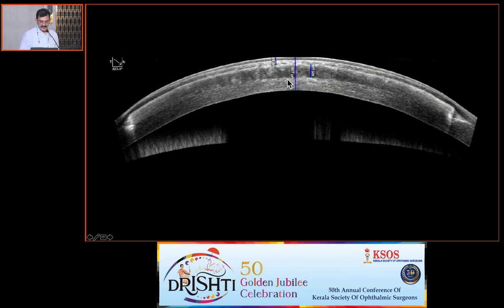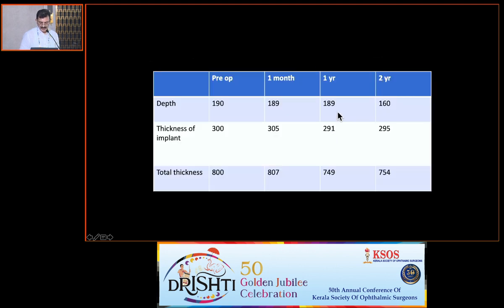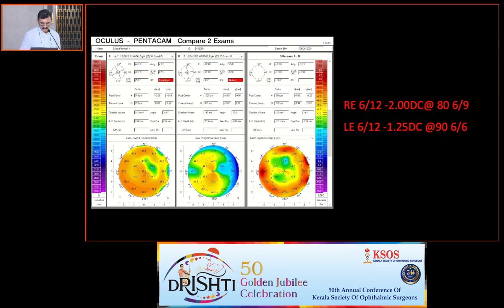And this one is kept under 200 microns thickness, and over a period of time, the total thickness Madhu has shown is 450, 500, but most of our cases are more than 600, 700 microns. The cornea becomes thick like a rock, like a thick ball. So these are the post-operative results. Patients improve one or two lines over a period of time. And with contact lens, of course, they improve dramatically, but our aim is without contact lens.